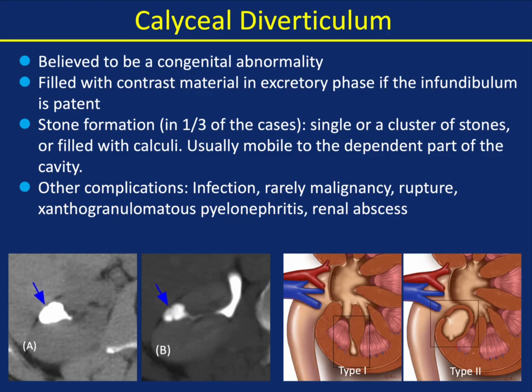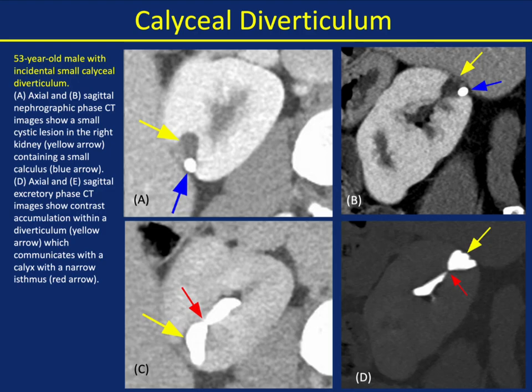A couple things to mention — I put this after the TCCs for a reason. One of them is calyceal diverticuli. Calyceal diverticuli may not opacify early on and so can be confused with a tumor. You can see stone formation in diverticuli, but not necessarily. You can have other complications from infection to rupture to XGP to abscess, and occasionally even malignancies. You can see a type 1 and type 2 here — the type 2 are probably the most confusing. Sometimes the calyceal diverticulum will not opacify early, and you may need delayed scans if you want it to opacify.